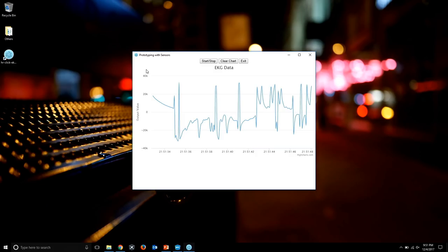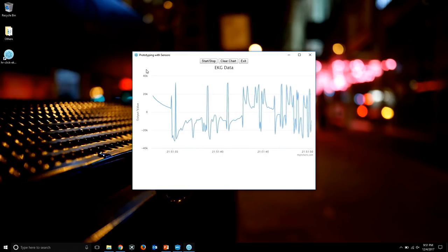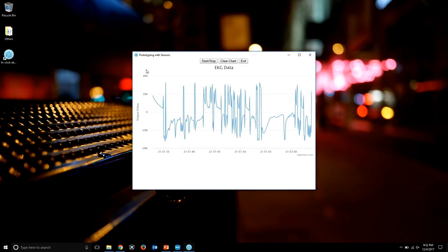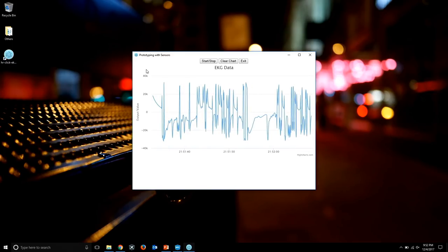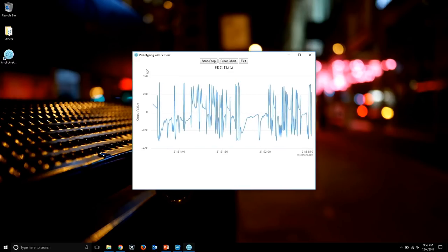Oh, yeah, you probably can't see that I have my finger. Hold on. For the camera, for the people out there watching. So I place my finger right on top right there, and then I'm just holding it. And it will give us very nice data. I don't know if you guys want to switch over to the plot that we're seeing. Yeah. It looks like I'm pretty healthy. Yep, it looks like we're all alive and good to go. You can play around with it depending on how you want to hold it. You place your finger nicely on a nice surface, and then it'll give us better data.